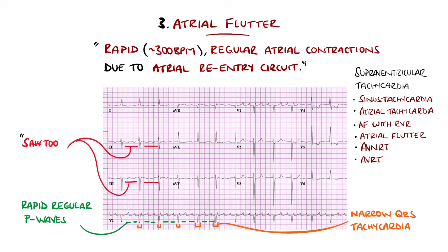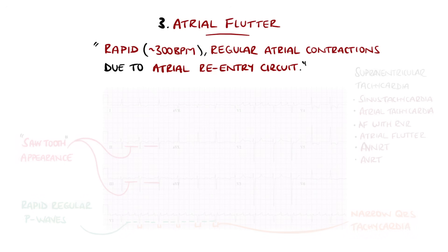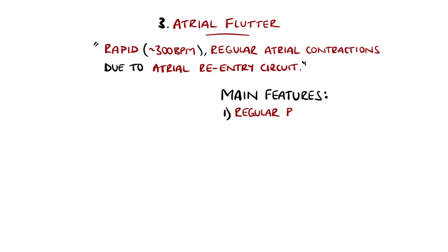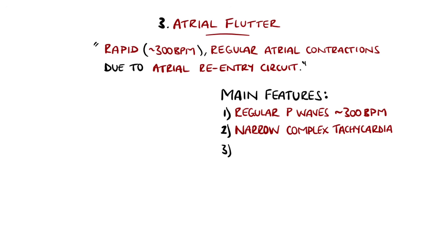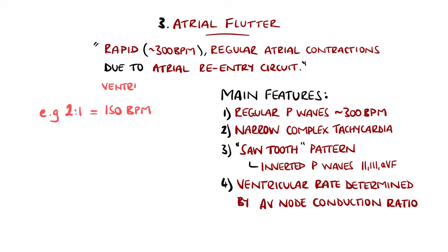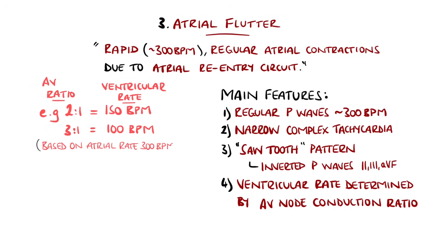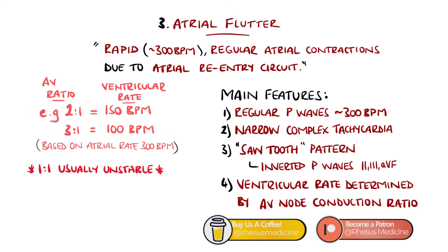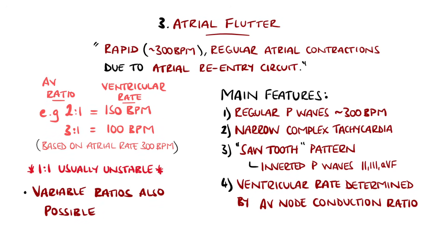The ECG in atrial flutter classically shows a sawtooth pattern from inverted P waves, usually in the inferior leads. It is described by looking at the ratio of non-conducted to conducted beats. Most commonly this is 2 to 1, giving a ventricular rate around 150 beats per minute. Higher ratios indicate a higher degree of block through the AV node. A conduction ratio of 1 to 1 is possible and is highly associated with instability and progression to ventricular fibrillation. These ratios can be variable, making the ventricular rate irregular, which is why it can often be mistaken for atrial fibrillation.